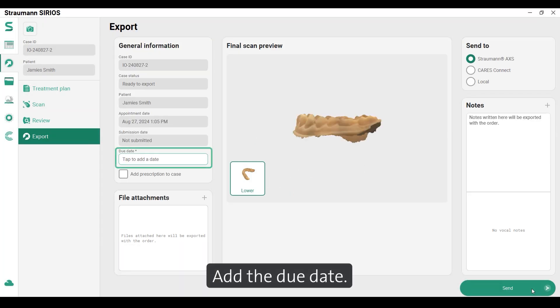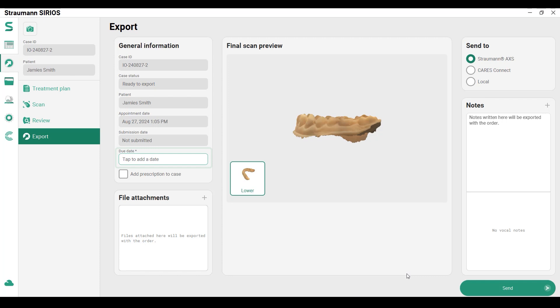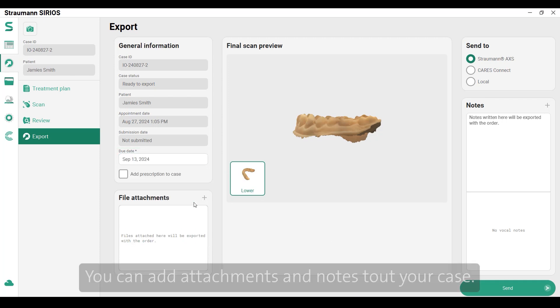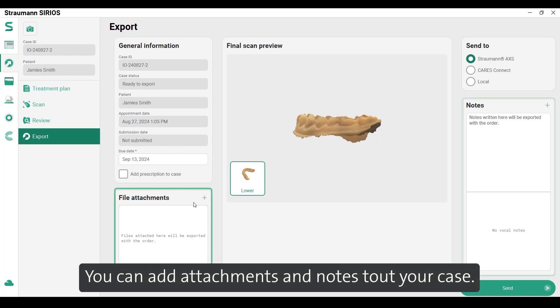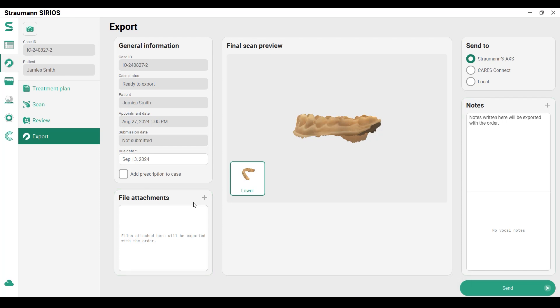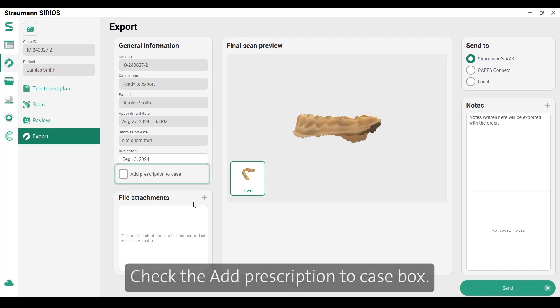Add the due date. You can also add attachments and notes to your case. Check the 'Add Prescription to Case' box.